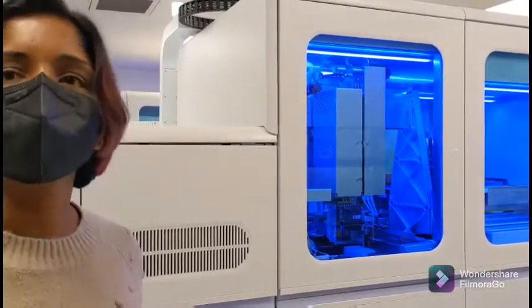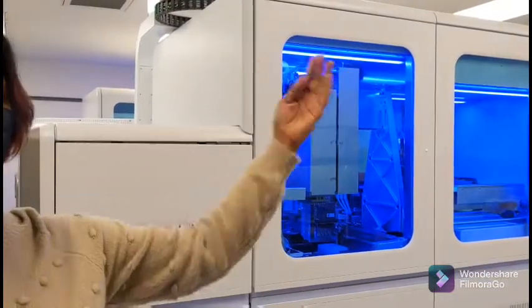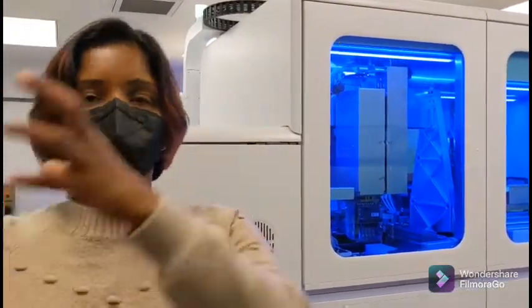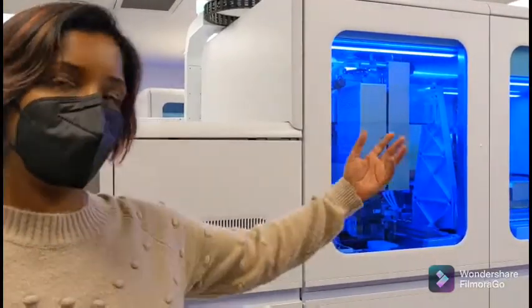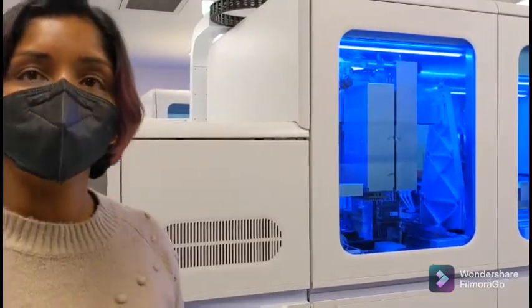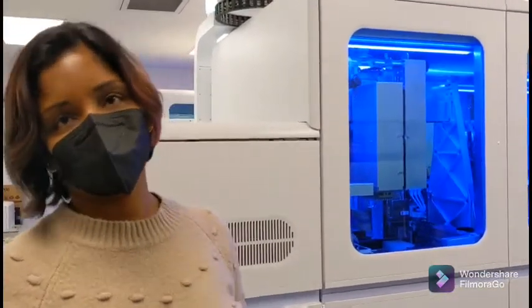So this is closer to the start of the process, somewhat. That's right. So intake, PCR, if positive, get pulled, sit in the fridge, get batched, go up for sequencing, extraction, and then actual sequencing, and then analysis and reporting of the results. But this also provides results for people who got the test and want to know if they're positive or not. So the results that come off of these machines are what get returned to the patient to say, yes, your sample was positive for COVID or not.